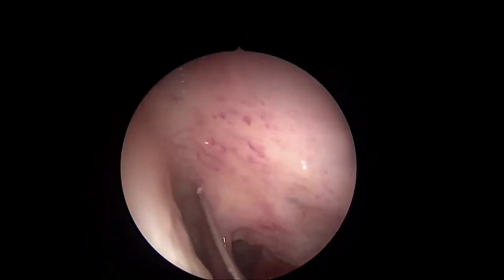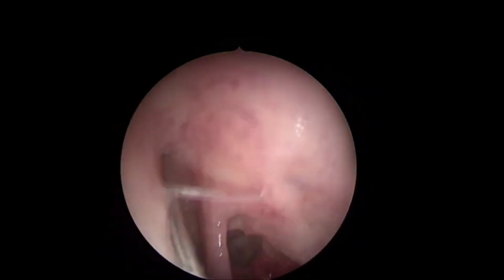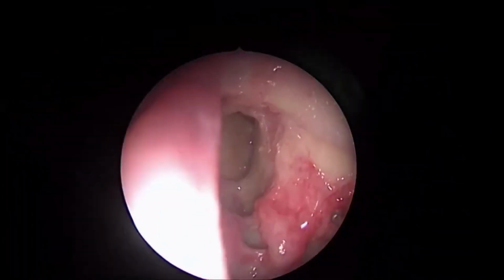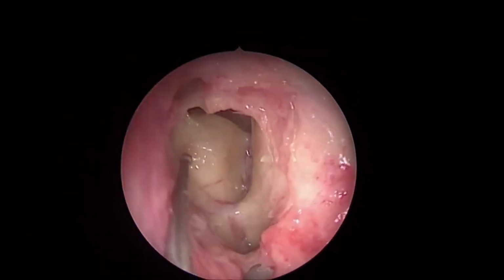So this frontal sinus is above, this is the floor. Draf had described a variety of procedures to marsupialize the frontal sinus into the nasal cavity to prevent future obstruction to ventilation and drainage, and we'll discuss those in detail today.